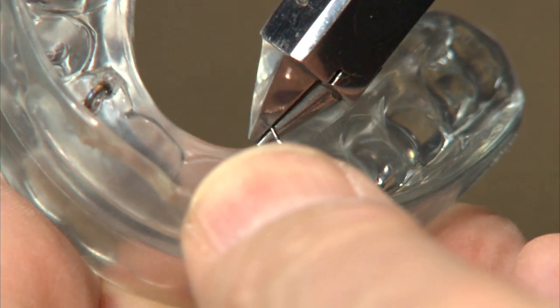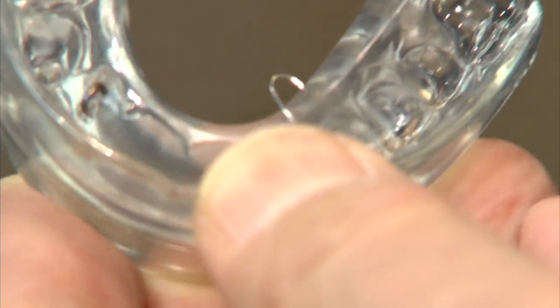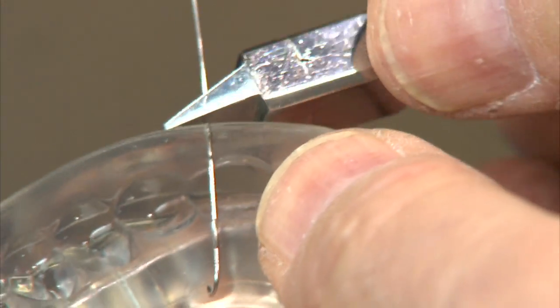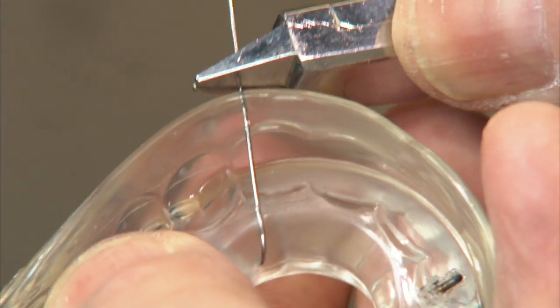Then we take and bend that wire like a little fish hook, and then we pull that wire into the appliance.